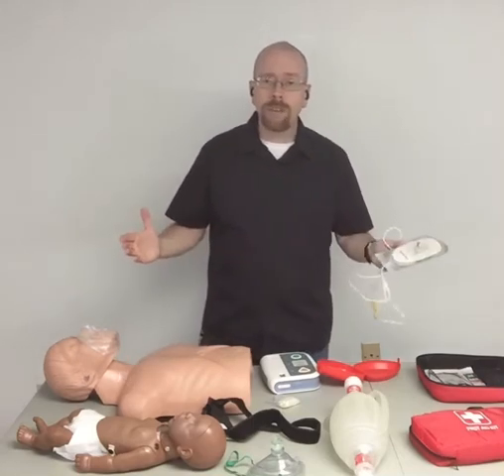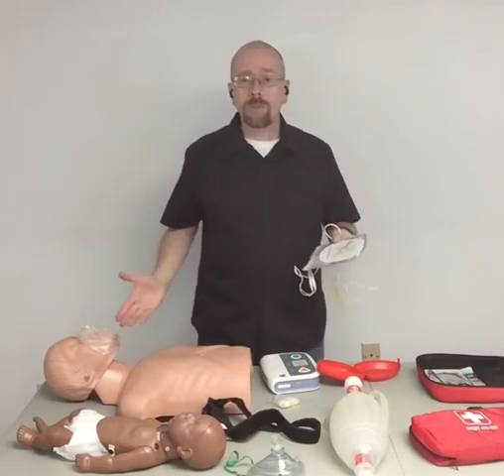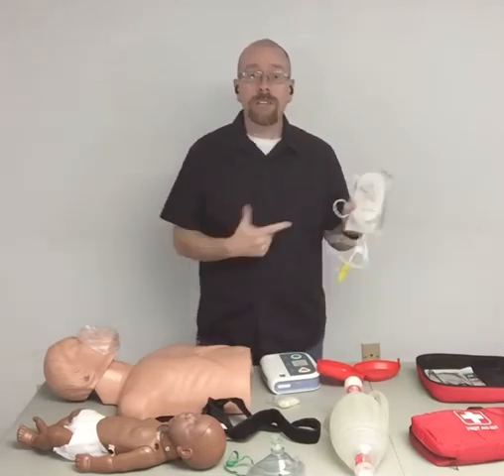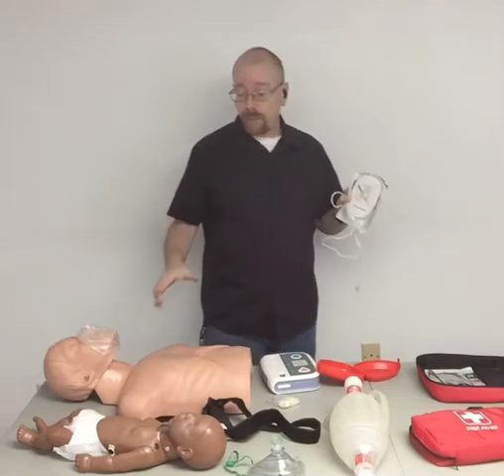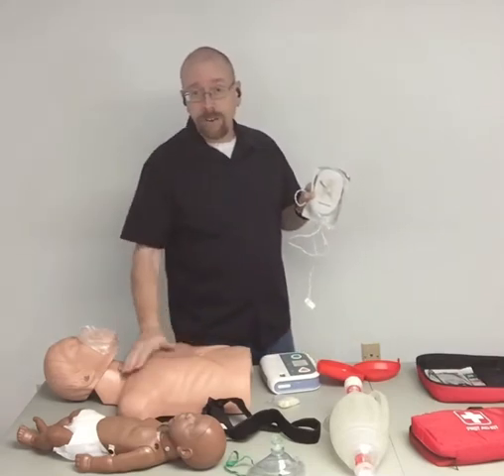I know it sounds painful, but if you rip the hair off and the person screams, they're alive. You really don't need the AED. So keep that in mind. So in this situation, we clear the hair off the chest.